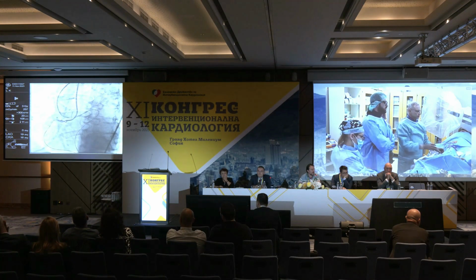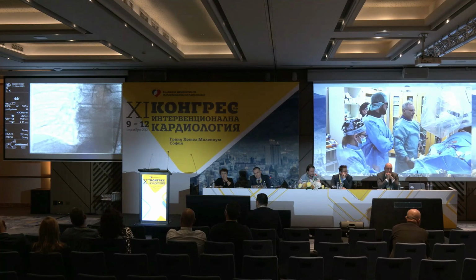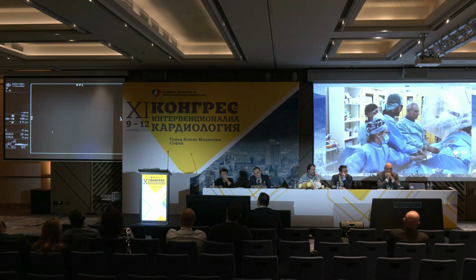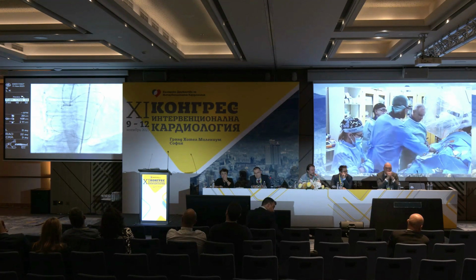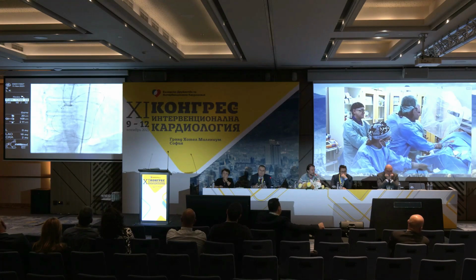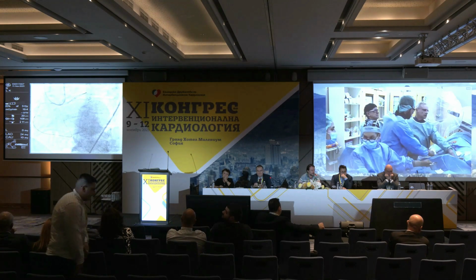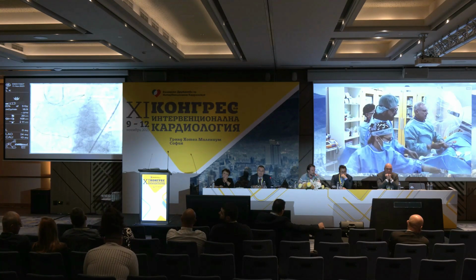Is this still Gaia third? This is the Gaia third, yes, okay, because I was preparing for a Gladius, and I might try the re-entry. You see here in 3 different projections that none of these projections were too far. I'll try a little bit whether I can really make it, because this wire is not too bad. We control that in 3 different projections, and it looks like it is going in the right direction. And I am trying to advance the microcatheter.